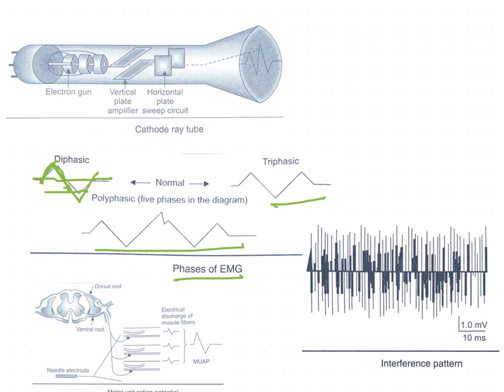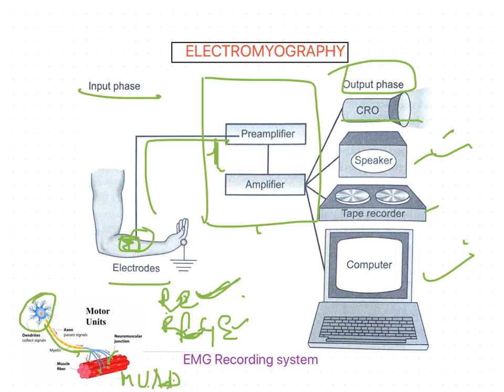Now, what is the other one? That is the amplifier. So what is the function of this amplifier here? The electrical activity derived from the body is very small and contains undesired signals, which need to be conditioned and amplified. For this purpose, an amplifier is needed. The amplifier is the part of the instrumentation system that conditions and amplifies the electrical output of the electrodes.